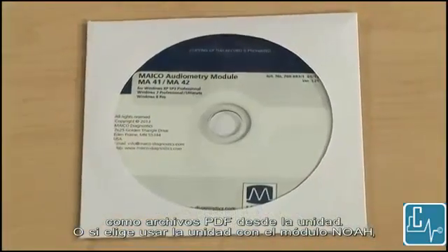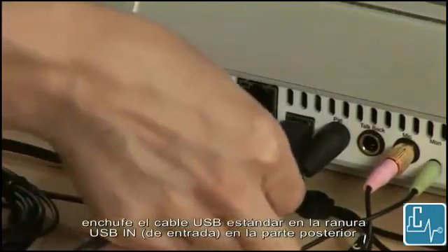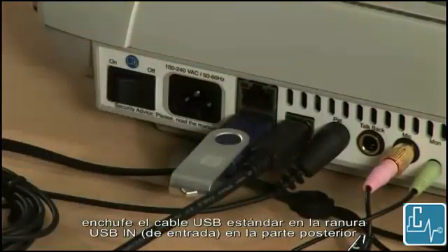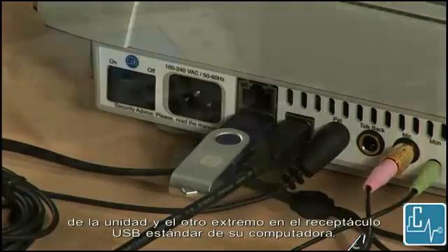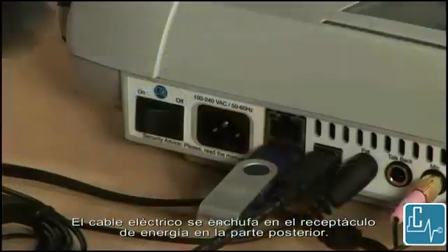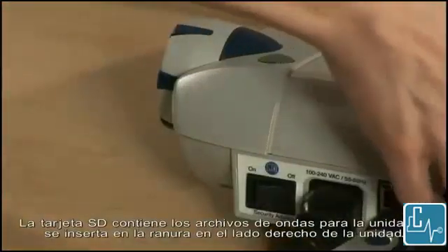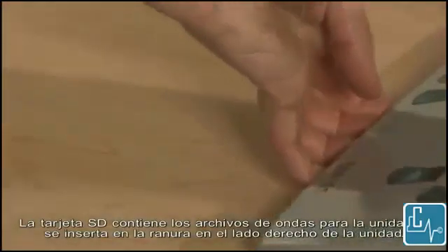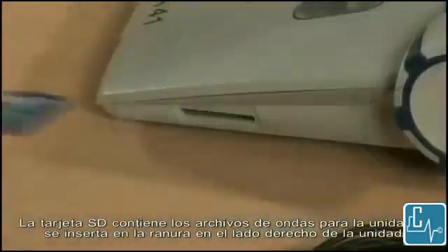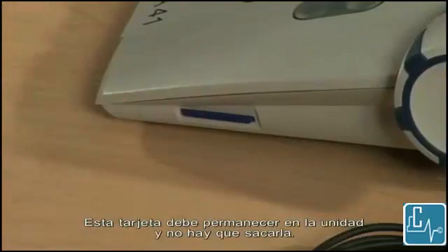If you choose to use the unit with the NOAH module, plug the standard USB cord into the USB in slot on the back of the unit, and the other end into a standard USB outlet on your computer. The power cord is plugged into the power outlet on the back. The SD card contains the WAV files for the unit and gets inserted into the slot on the right side of the unit. This card should stay in the unit and does not need to be removed.